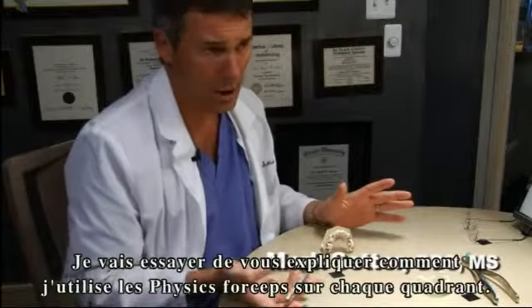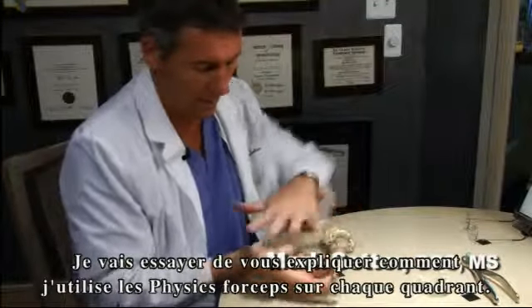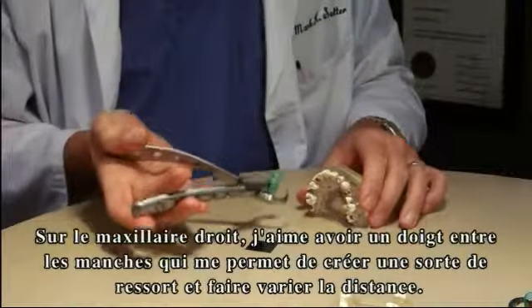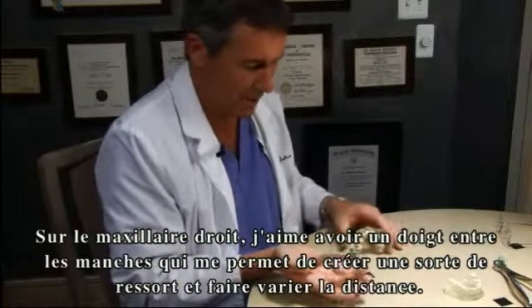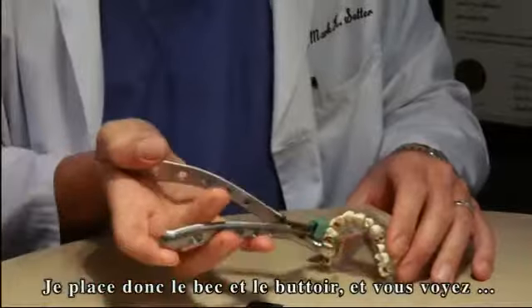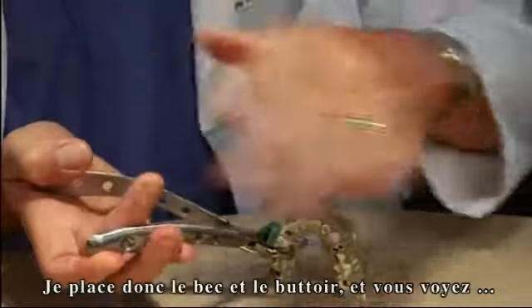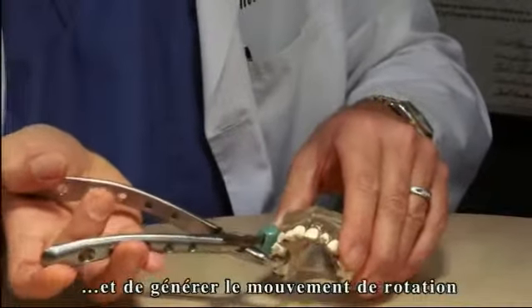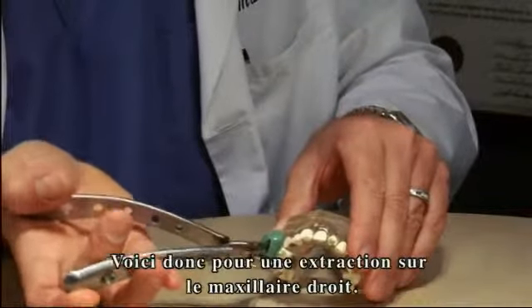In an effort to explain hand position in each quadrant, I'd like to show you how I use the hand position in the forcep in various quadrants. In the upper right posterior, I like to have a finger between the handles that acts as a spring, allowing me to vary the hand distance. In the upper right, I can place the bumper and position the beak. The hand position allows me to vary that distance as anatomy determines, providing the rotation pivot point.